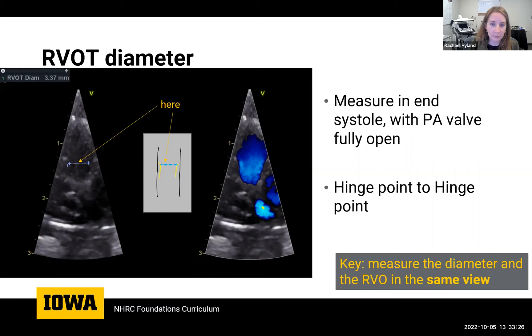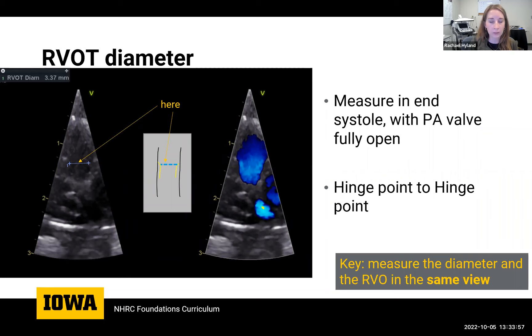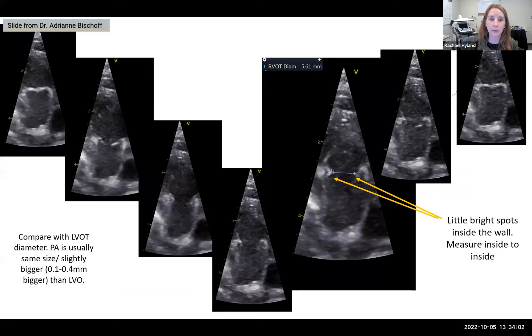The flow that can actually travel through the valve is within the hinge points — that's the most accurate way to represent the true outflow for the RV or LVO. You'll start to get a feel for what normal values are for smaller and larger babies. Generally, the LVOT and RVOT diameters will be pretty similar; if one is different, the RVOT is often a little bit larger. Just take practice, clicking through frame by frame through the entire valve to see what the hinge points are doing.